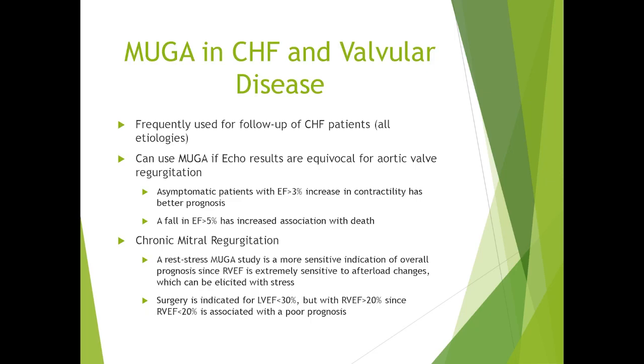In other disease entities such as chronic mitral regurgitation, some literature suggests that a rest and stress MUGA, so a MUGA obtained at rest and then at the time of stress, could be a sensitive indication of overall prognosis, because you could get LVEF. You might also be able to get RVEF using a first pass study. So there are indications for surgery given certain LVEF and RVEF. Knowing accurate values could be quite important in terms of appropriately managing the patient.